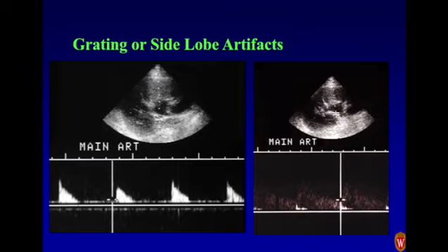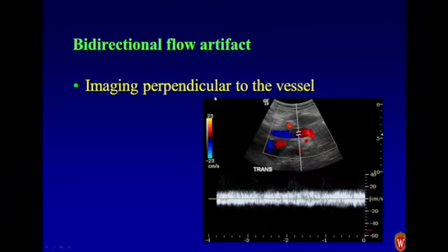I don't know where, but if you see this and it makes no sense, here's my advice. Don't take the picture, and then you don't have to explain to some surgeon what a grating lobe artifact is. Just don't take the picture.